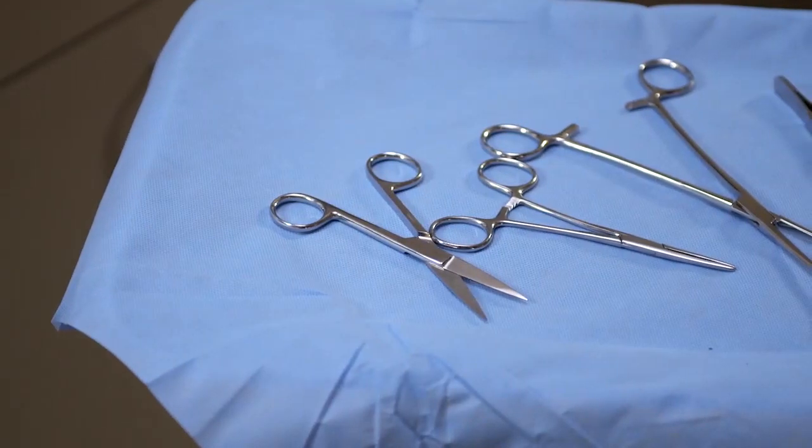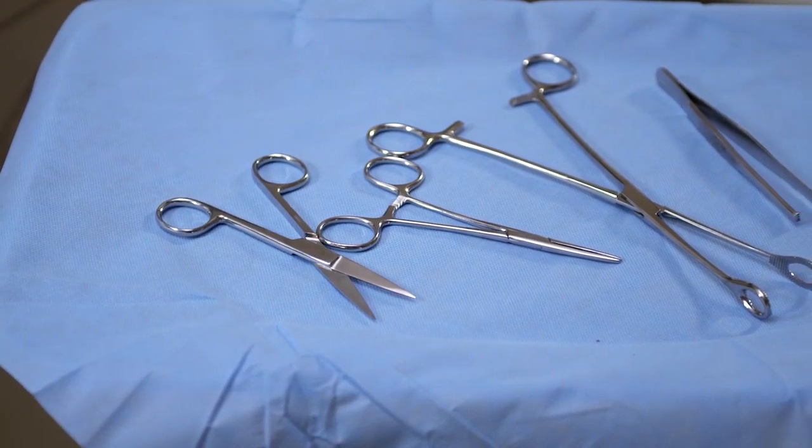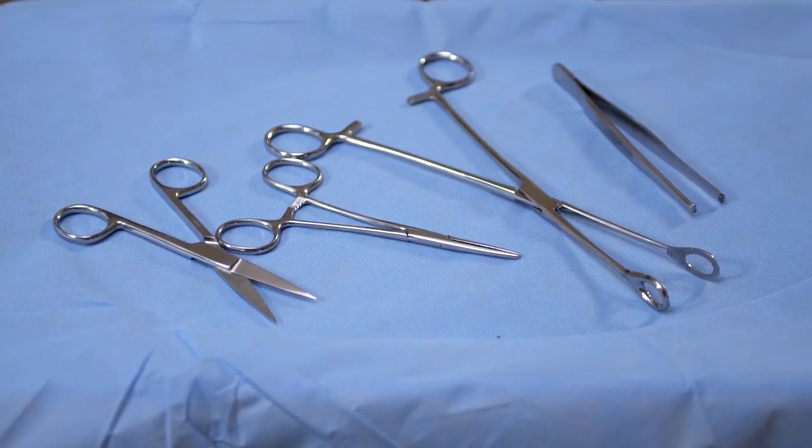In this procedure, you will learn standard precautions for removing contaminated matter from instruments in preparation for disinfection or sterilization.